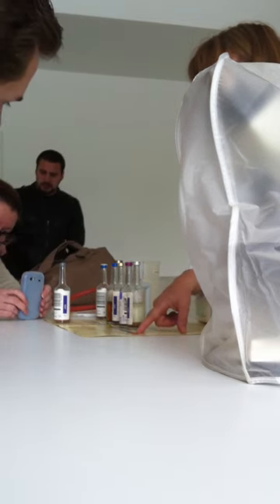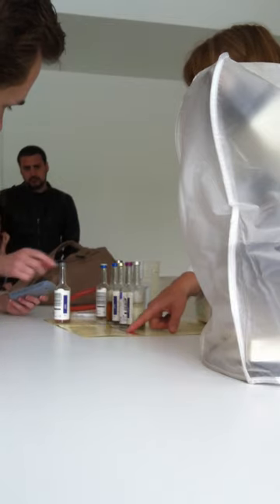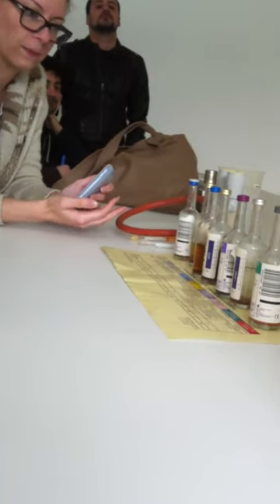The lilac or purple, so-called lilac, because sometimes the bacteria are facultative intracellular, so you can find them inside the cells, and there is a component, a plus component, which lyses the cells, and that's why the bacteria will be free. There is a mycosis bottle for fungi, especially Candida, and one is a red color for mycobacteria. But we also have a special lab, a mycobacterial lab, the so-called Koch lab, and they are using this bottle in this lab.